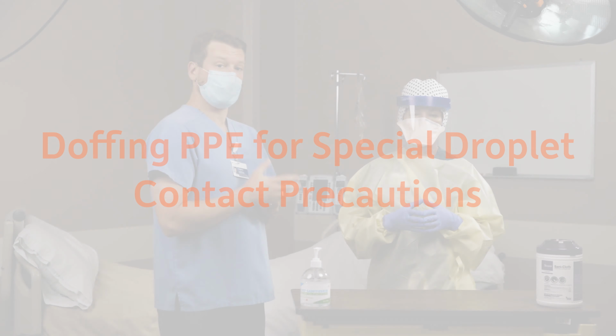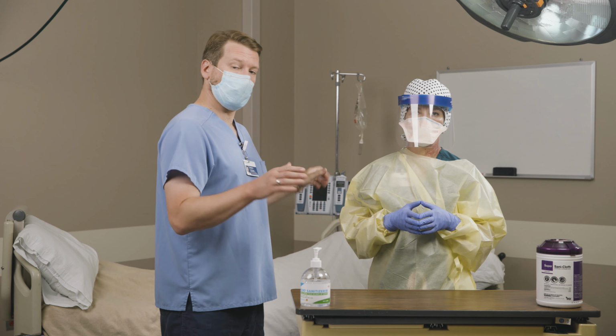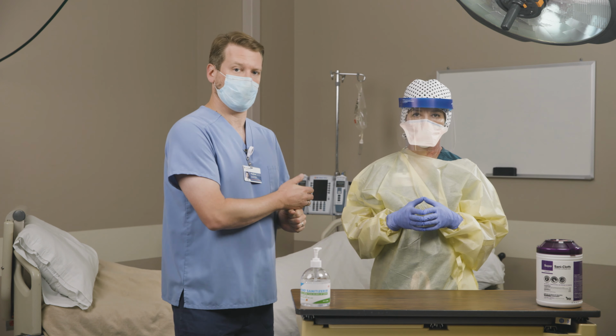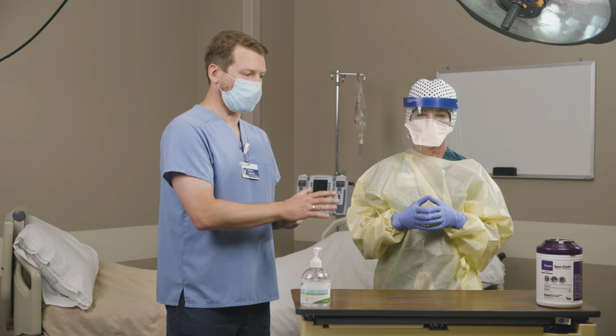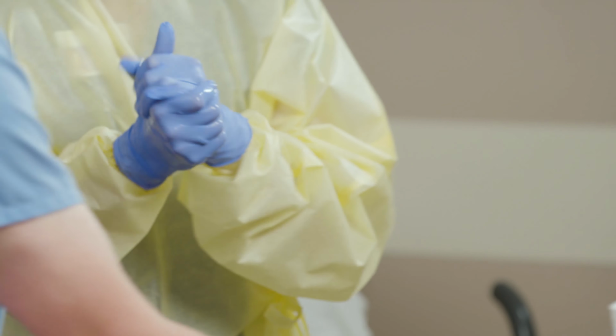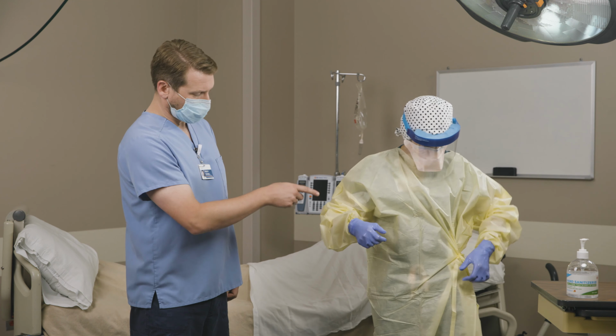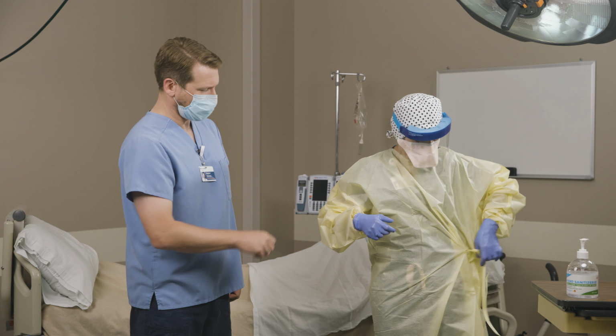Now Krista's getting ready to doff her PPE ensemble. So the setting is we are in the patient room. She has just finished care with the patient. She's going to come to the door. She's going to perform hand hygiene. Next, she's going to doff her gown and gloves. She's going to break the tie or untie it at the waist.